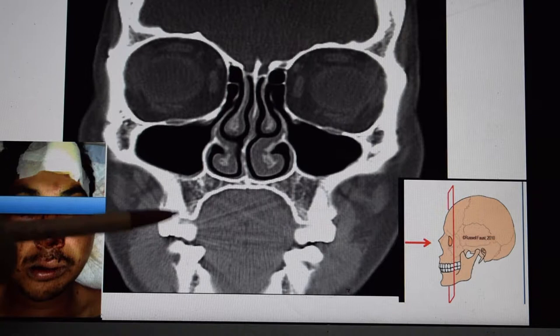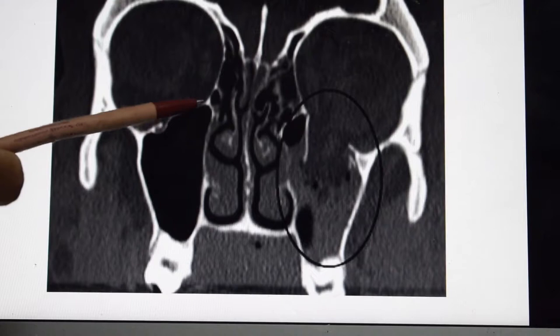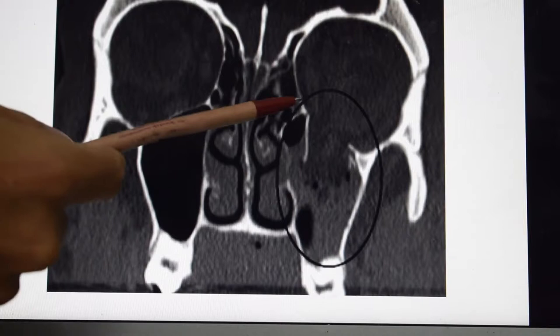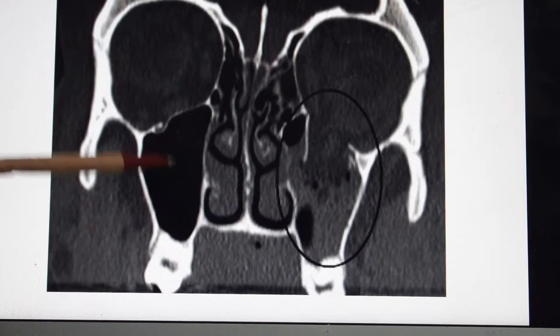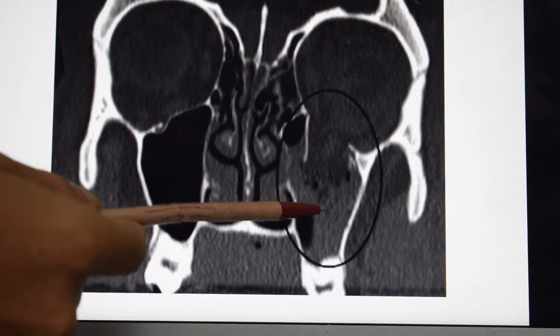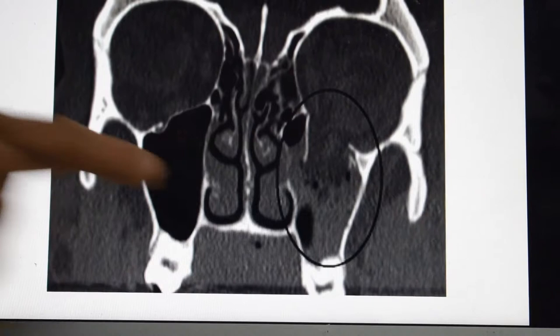Now this is an abnormal CT scan. On the left side you can see the intactness of the orbital cavity or bony orbit, but here you can see a fracture of the orbital floor. Because of this fracture, the contents have sunken down into the maxillary sinus. You can see the intactness of the maxillary sinus on one side, but here some substance is present in the maxillary sinus.